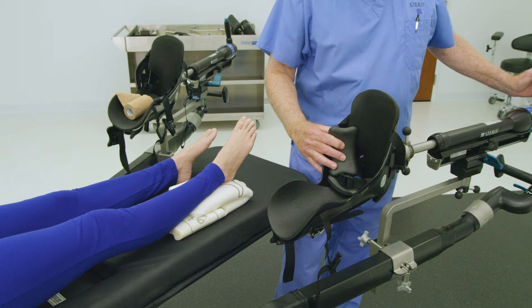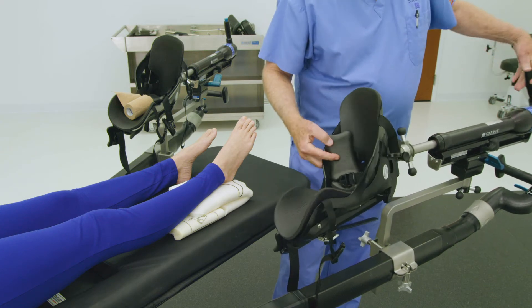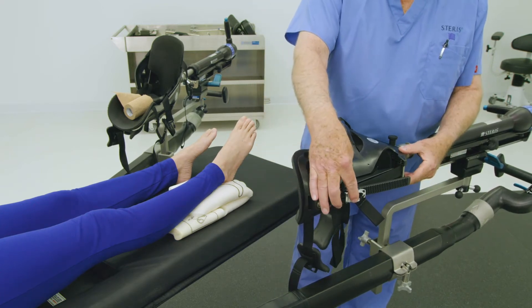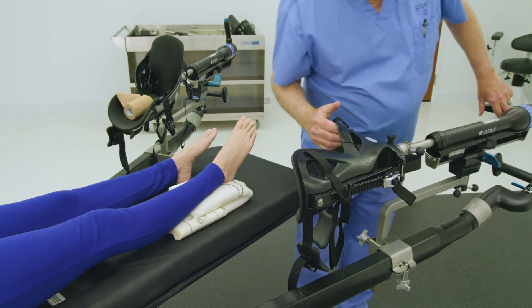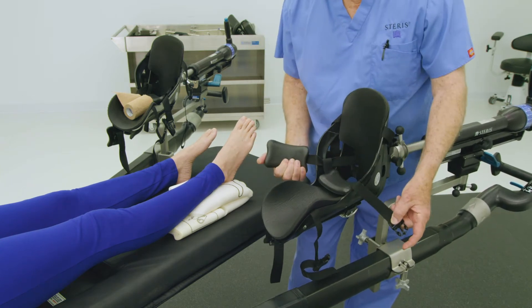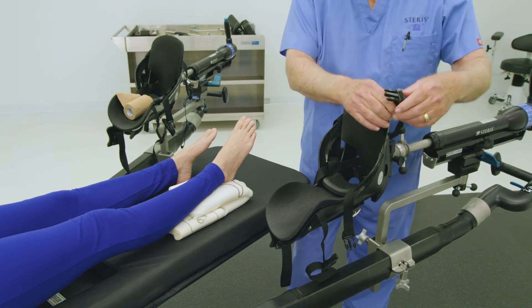Ensuring proper patient foot placement in the traction boot will secure the patient's foot when traction is needed. Complete the following steps to ensure proper alignment in the boot. First, loosen the middle strap of the traction boot by releasing the strap ratchet found on the back of the boot. Release tension by lowering the ratchet assembly to the bottom of the boot. Loosen the strap by pulling outward. If the buckles on the bootstraps are not released, open the three buckles by squeezing tabs and lace straps over the exterior of the boot.